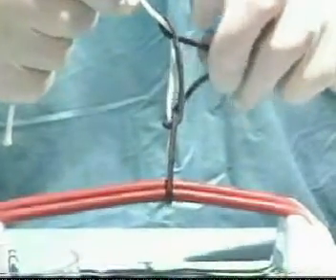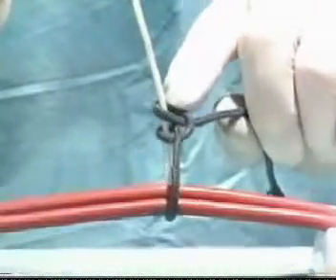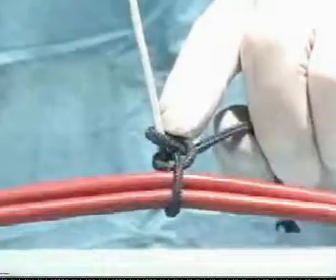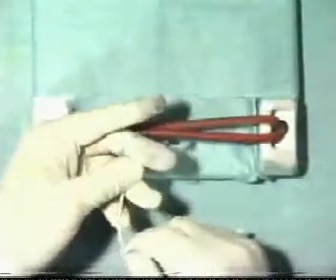And then a similar throw using the index finger again. Once these two throws have been cast, push them down into position using the index finger, tightening to the correct tension.